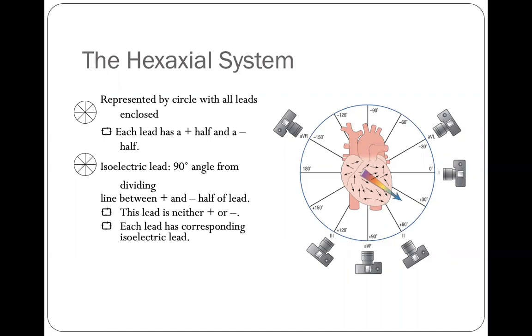And you'll want to get used to which leads are biphasic to each other. Lead 1 and AVF are biphasic to each other. Lead 2 and AVL are biphasic to each other. Lead 3 and AVR are biphasic to each other.